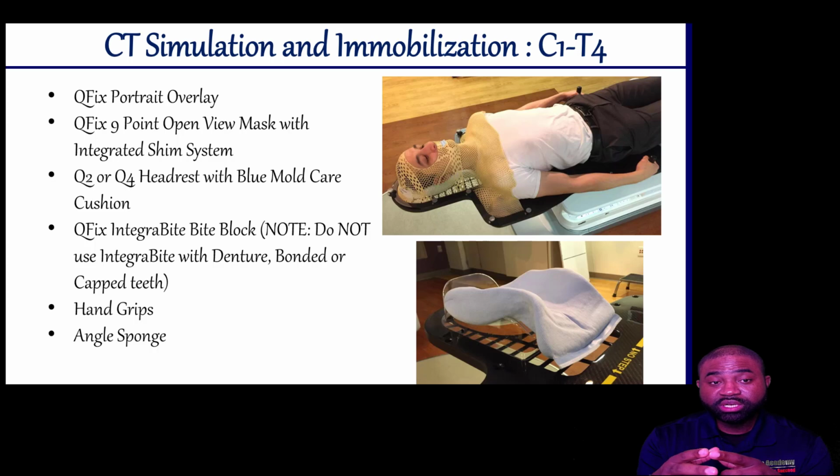The patient's natural tendency is to fidget or move during treatment.